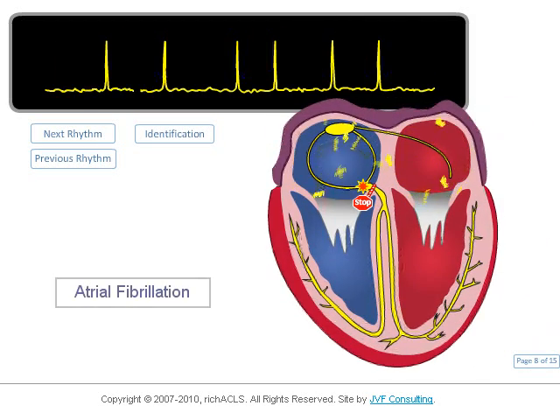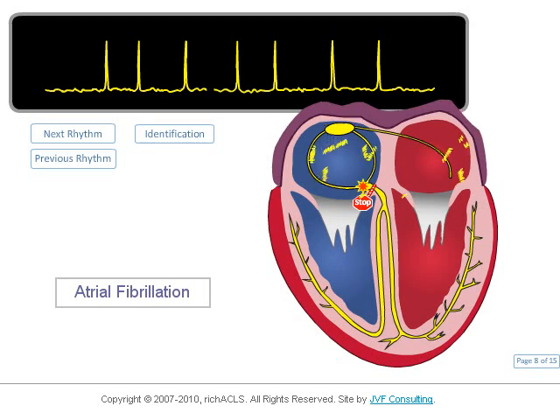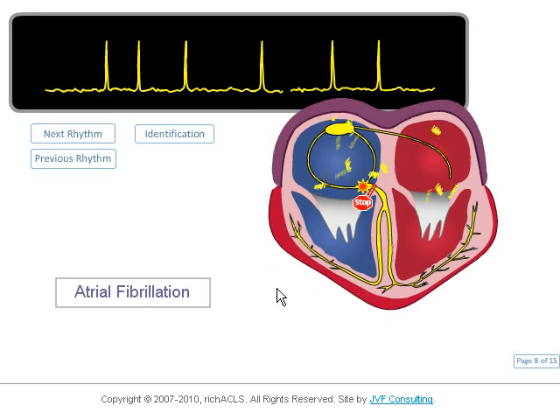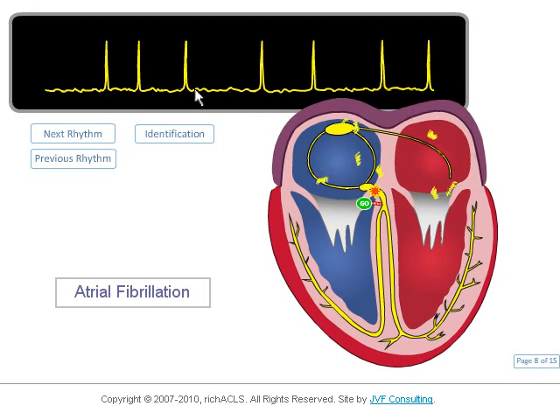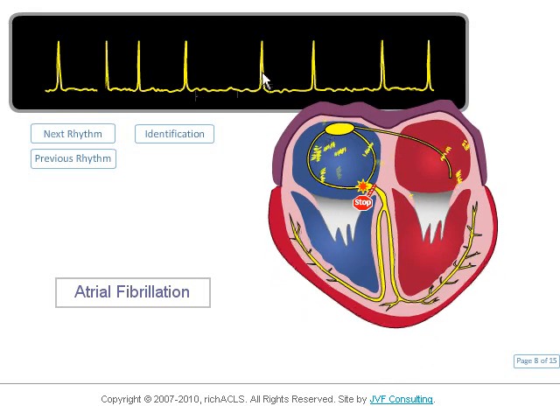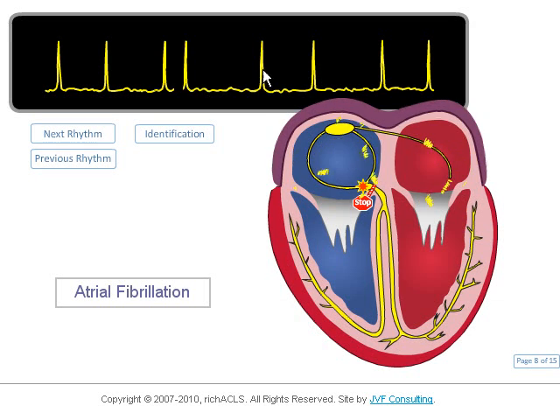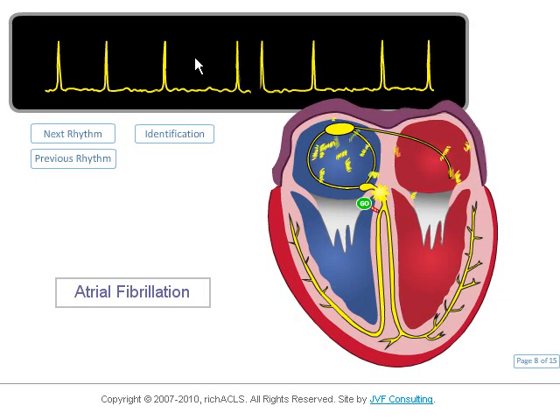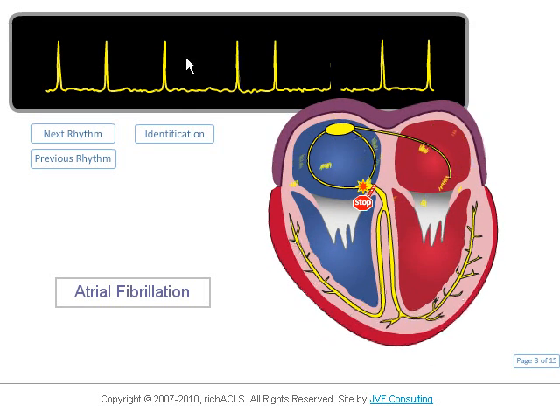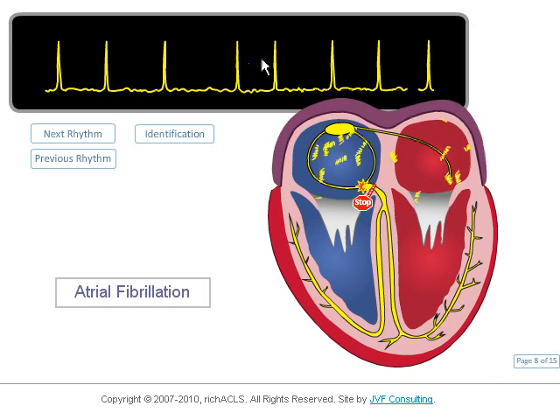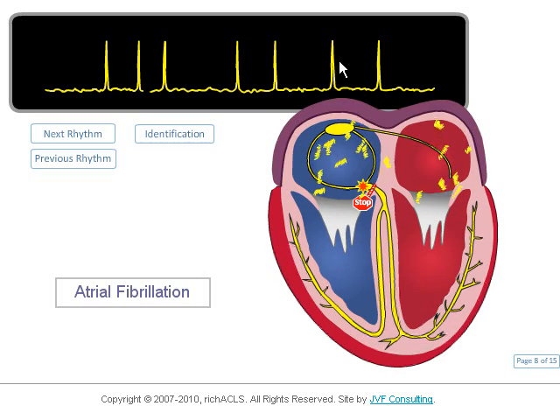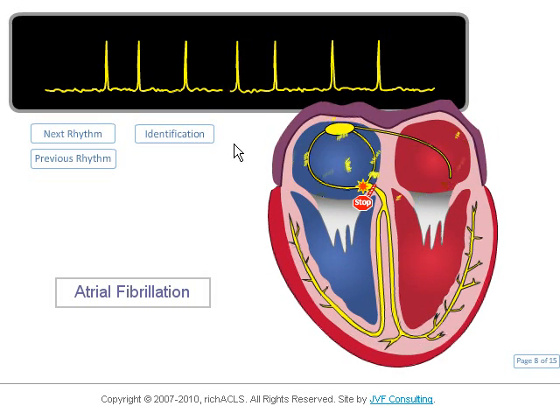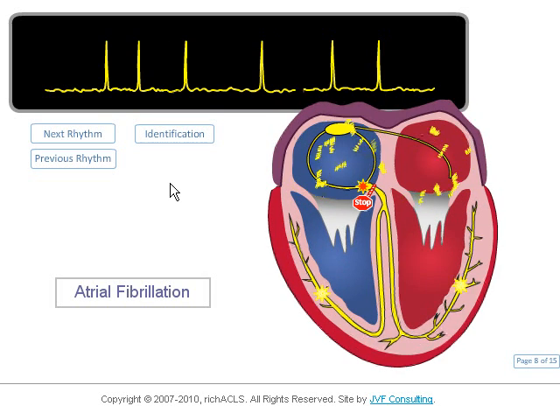In this rhythm, atrial fibrillation, we don't see P waves. The QRS is narrow and the rhythm is irregular — actually the most irregular rhythm there is. The rate is about 80.